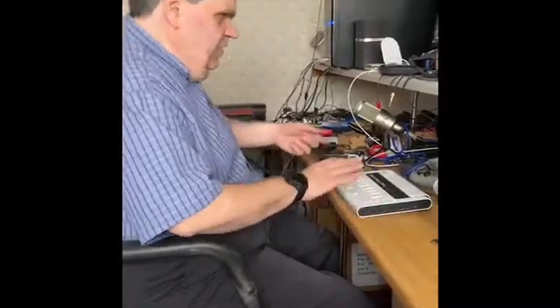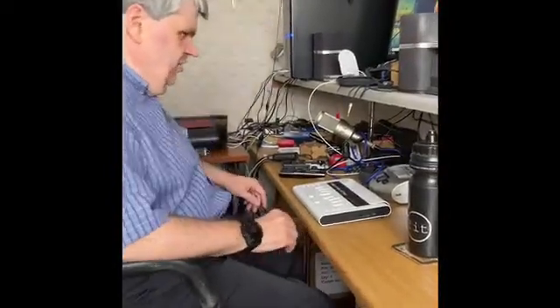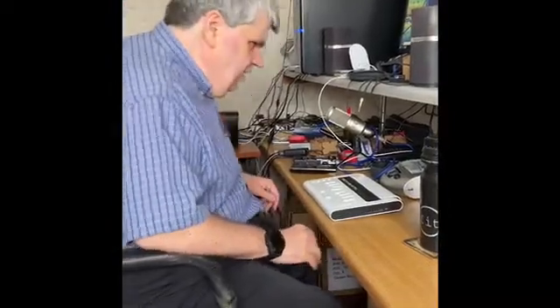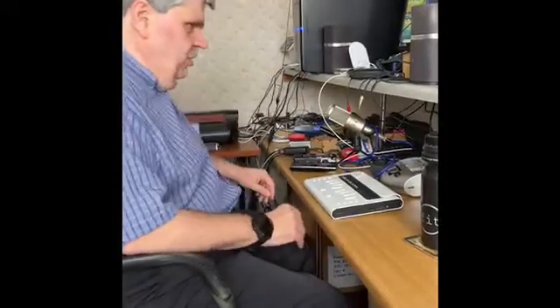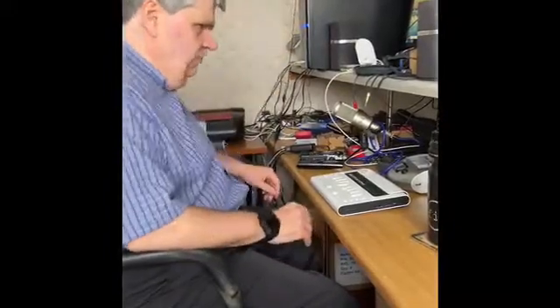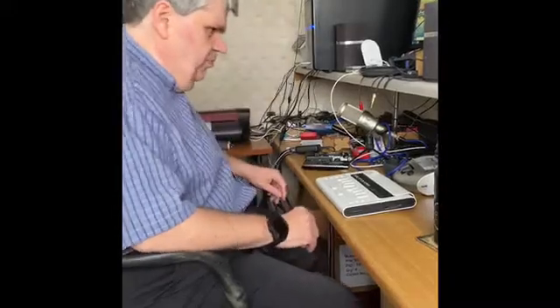It also has an HDMI port, so we can plug in a monitor, so sighted people can see what the student is typing. And it also has USB ports, so we can plug a QWERTY keyboard into it, which means that if you don't know Braille, you can type in QWERTY and it will be translated to grade 2 Braille inside the note taker, depending on what screen reader you've got.